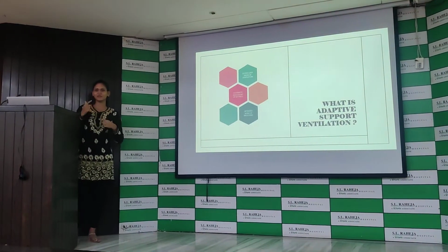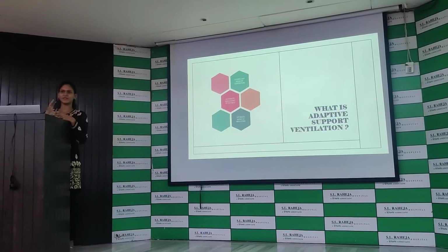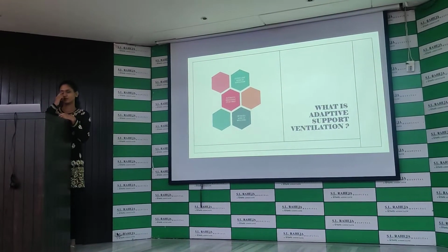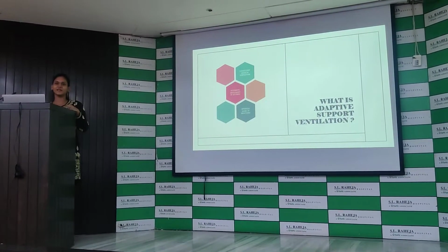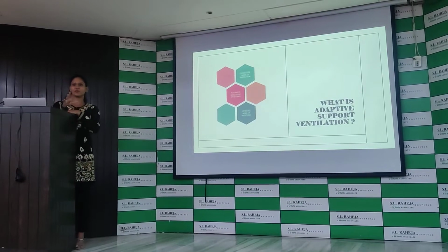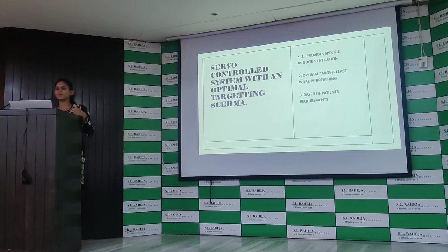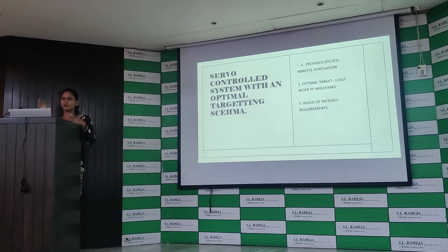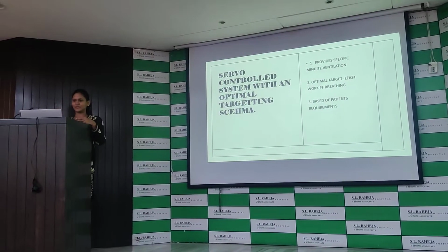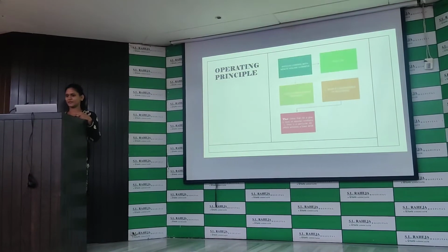So this occurs from breath to breath in ASV. There is automatic adjustment of settings according to this closed loop mechanism, and it optimizes the work of breathing. The entire principle is to minimize the work of breathing. That is what we are concerned about. It does this by providing a specific minute ventilation target, with the least possible work of breathing, based on the patient's requirement through the closed loop mechanism.